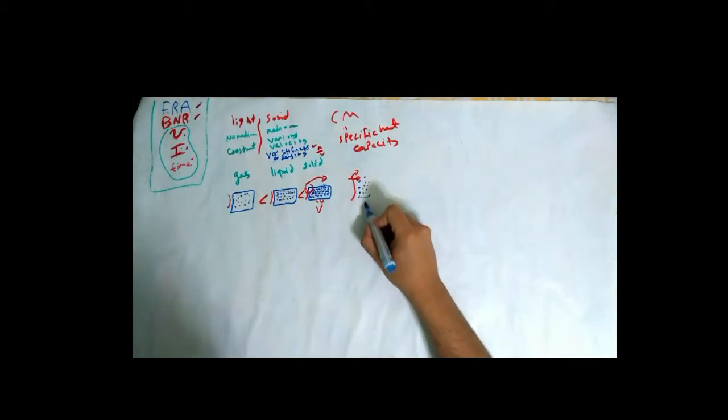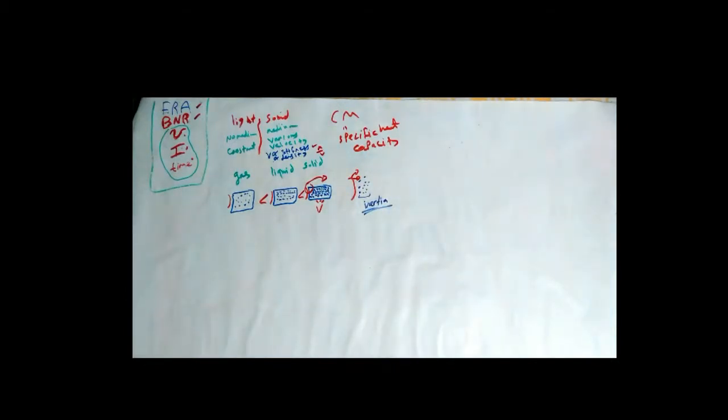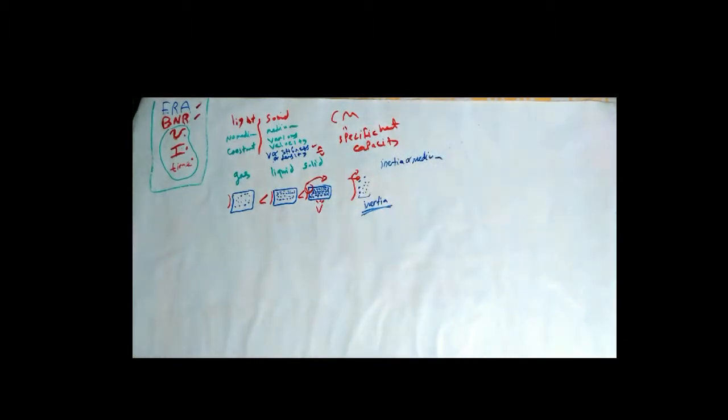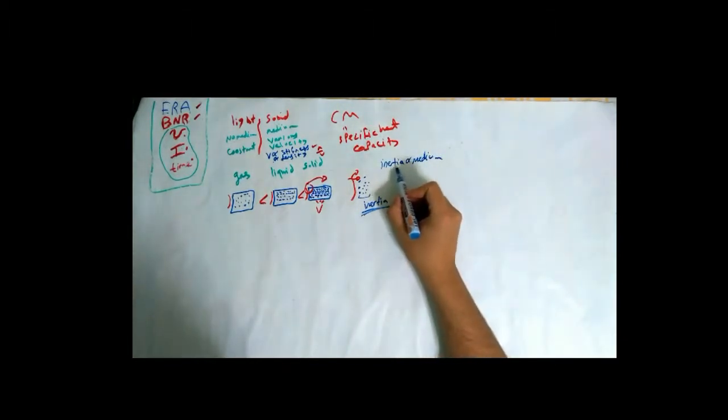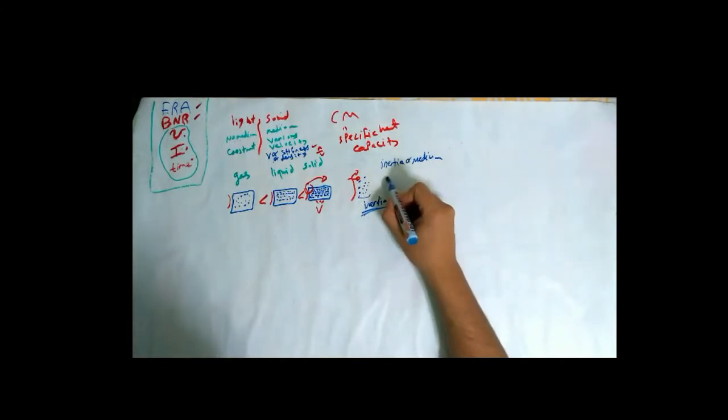We call this the law of inertia, or inertia, which means that it is the tendency of any object to maintain its state of motion or rest. Since we have different materials and different mediums, we have different inertia. So inertia, and the degree of resistance of these atoms and molecules, depend on the medium. In physics, we call this resistance inertia, but in acoustics, we call it acoustic impedance.